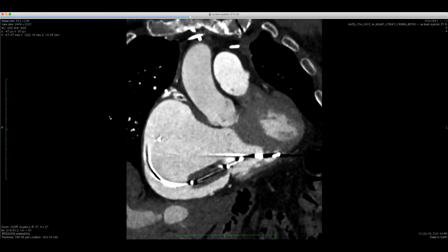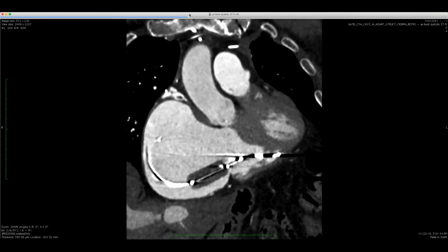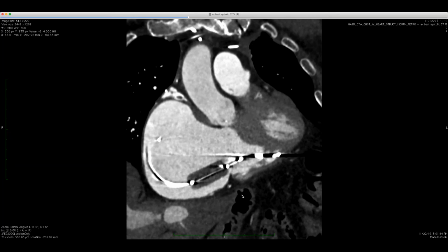Have other people been seeing those yet in their institutions? Nope, not at all. Never. Is it like FORM something? Yes, it's FORMA, the Edwards Forma device. You place this through a percutaneous approach, and that's what it should look like in the prior image that I showed you. Anyway, those are the cases I have this week.